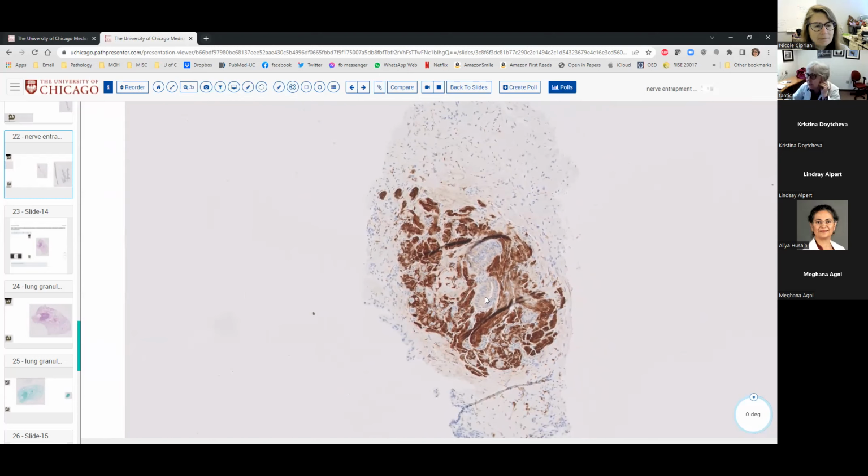This was just signed out as benign prostatic tissue. So Dr. Antich, would you think that this is something like just displaced during the biopsy, or? No, I know for sure because I look at prostates all the time. Very often we see benign prostatic glands next to the nerves. Okay. And ganglion cells. Therefore, that's a normal finding.